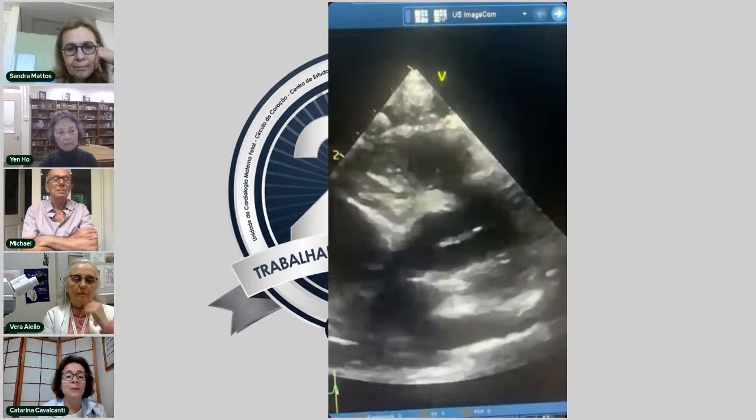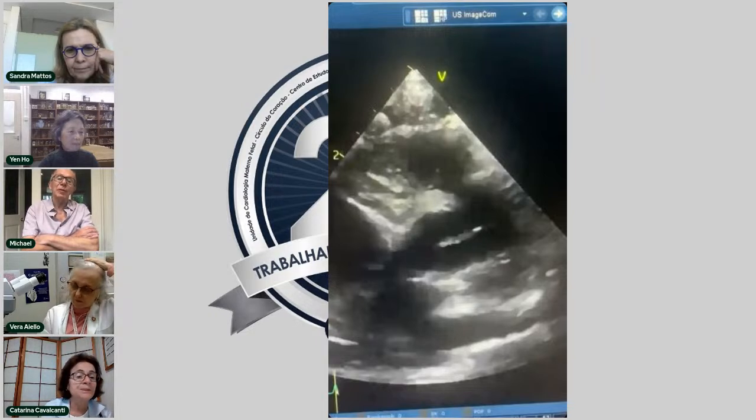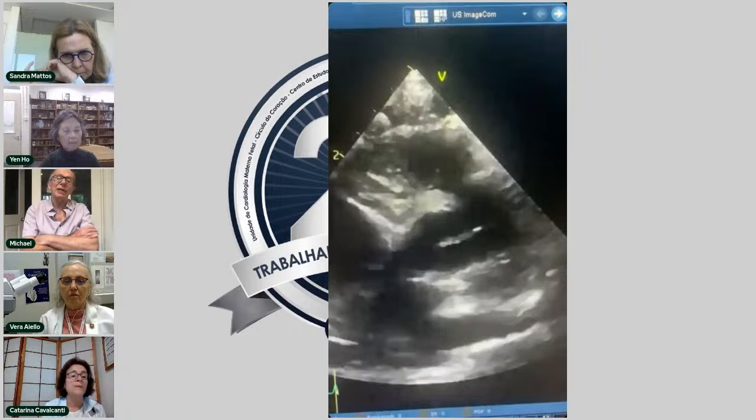Mike, I have a question, please. I missed the beginning of the presentation because my connection was not good. I didn't see the other LAD. Did you show both LAD? I don't think we did, but on another clip, which I didn't send to you, with a short axis of the aorta, you can see the right coronary and the left coronary dividing into LAD and circumflex. Okay. So there was definitely a second LAD. A good question. No, we did see it.